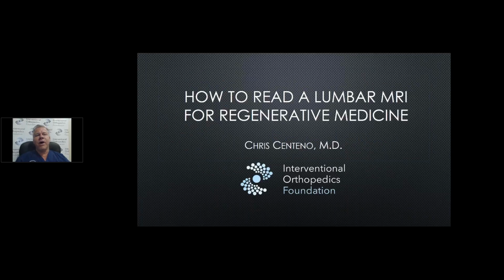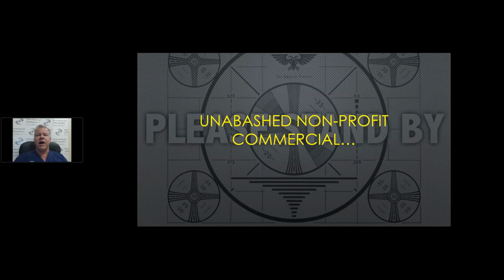So today's webinar is how to read a lumbar MRI for regenerative medicine. And this is on behalf of the Interventional Orthopedics Foundation. My name is Chris Centeno. I'm one of the board members of the foundation, and also been very involved in this type of work for quite some time. And I'll go into that just a little bit here.